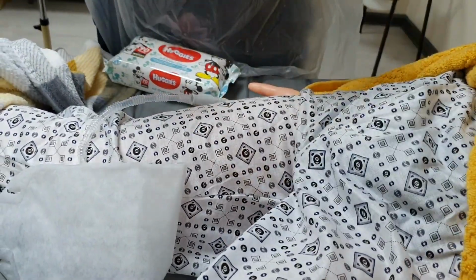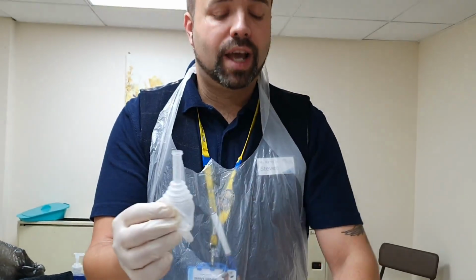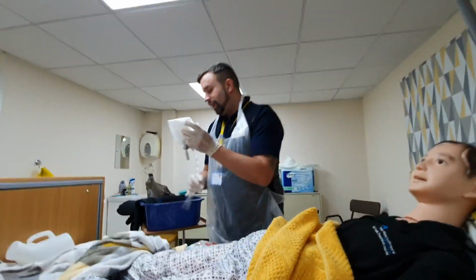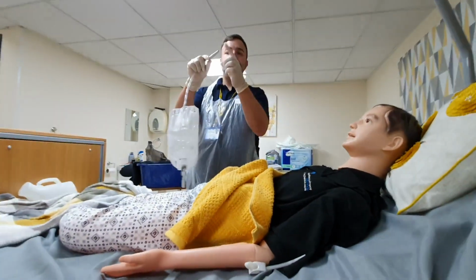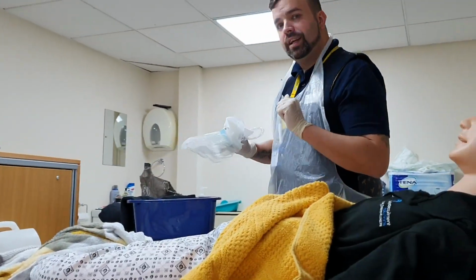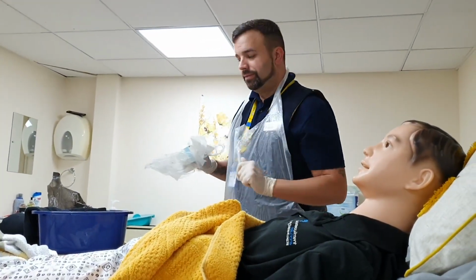Now, with a convene, it's important that these are changed daily, and it's really important that you clean the penis as well. So that's how to use your convenes. Now, the bags can be changed easily just by taking them out and putting them in. Okay. That's the end of the urine section for using the equipment.